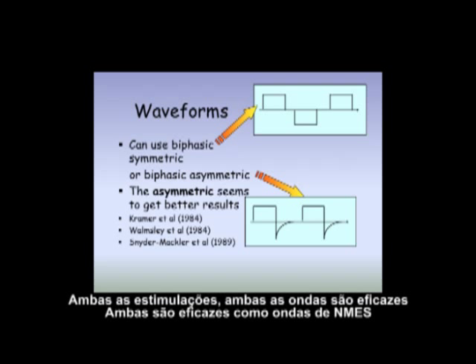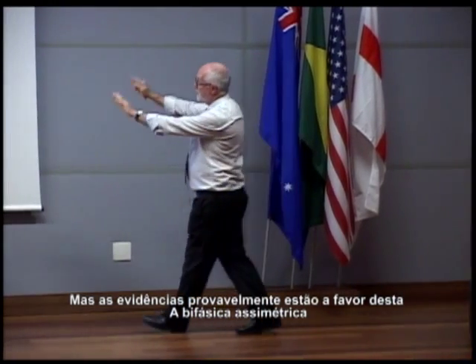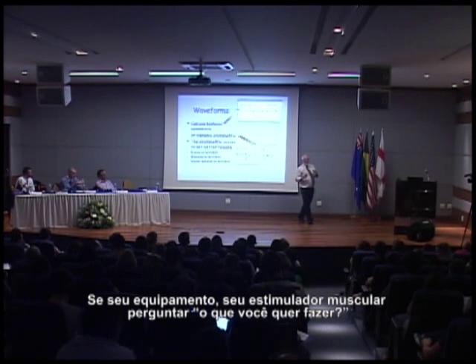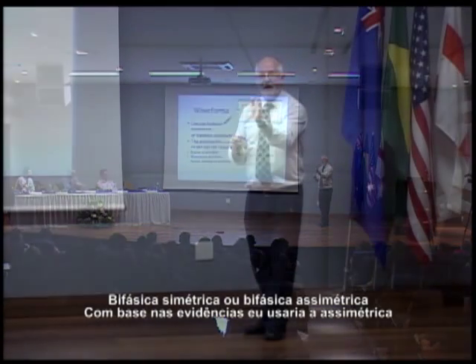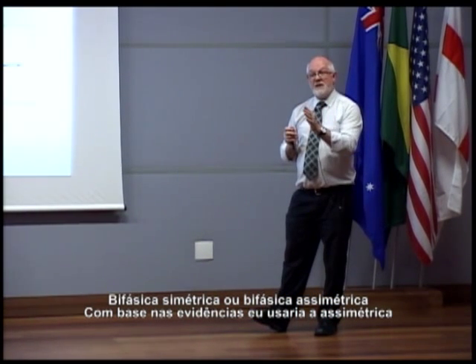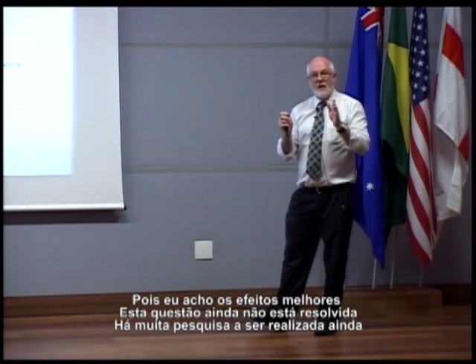Both of these waveforms are effective. They are both effective as NMES waveforms. But the evidence probably comes down in favor of the biphasic asymmetric. So if your muscle stimulator says, do you want to do biphasic symmetric or biphasic asymmetric, based on the evidence I can see, I would use biphasic asymmetric because I think the effects are better.